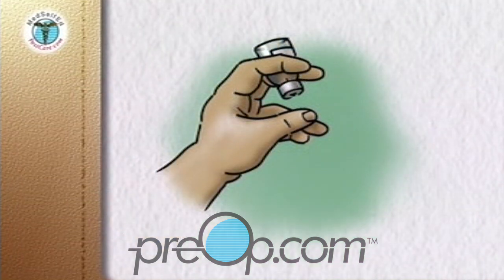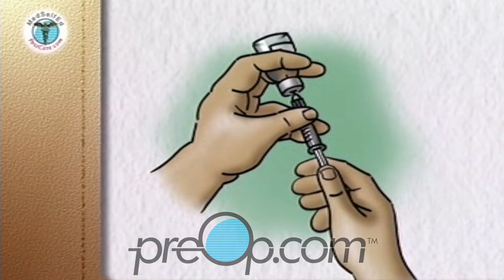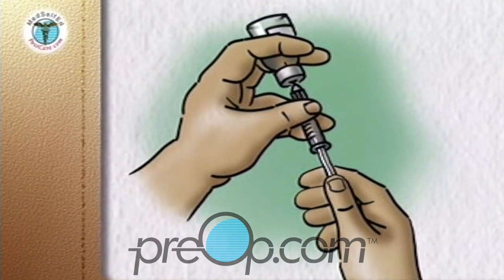Go back to the longer-acting cloudy insulin bottle, turn it upside down, insert the needle into the liquid, and slowly pull back the plunger to measure your total dose — in this example, 25 units. You are now ready to give your injection.